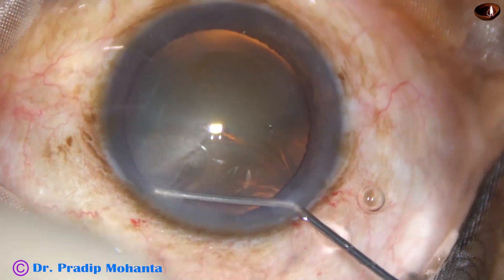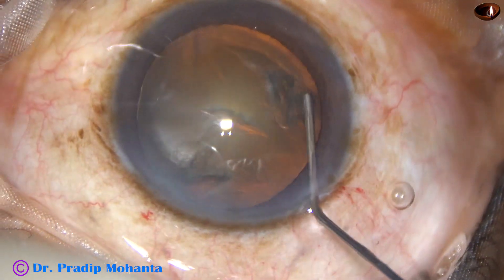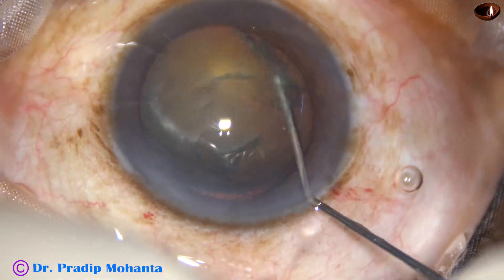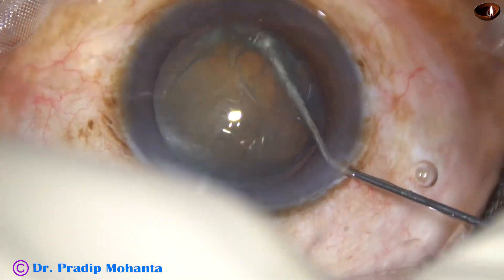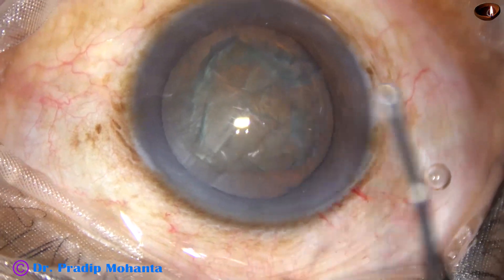This is real-time hydrodissection. Hydrodissection is done, and now we can see that the cataract is not very soft.